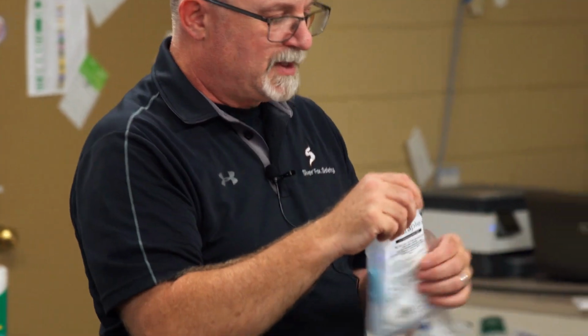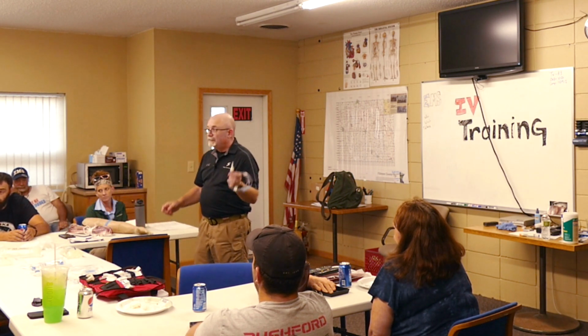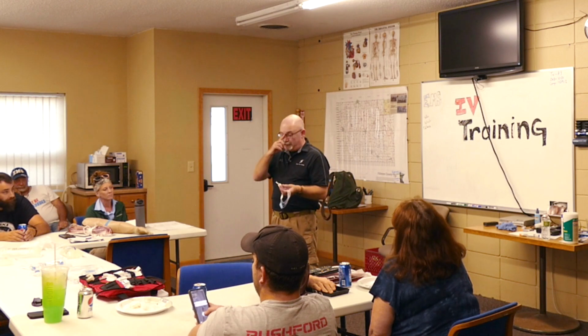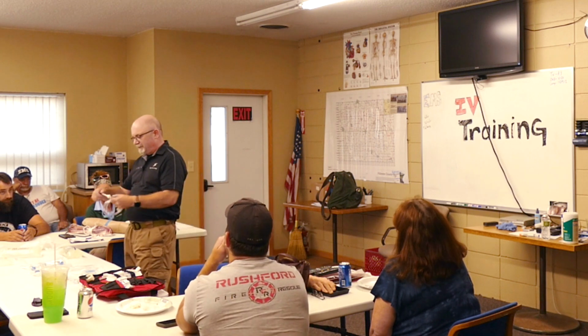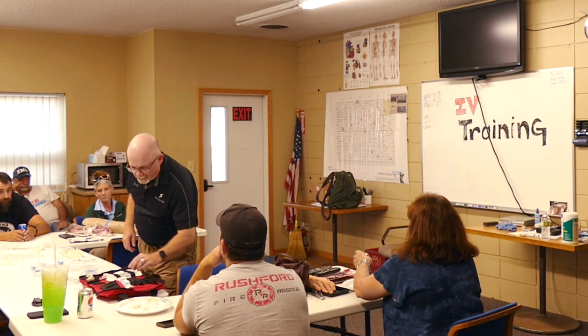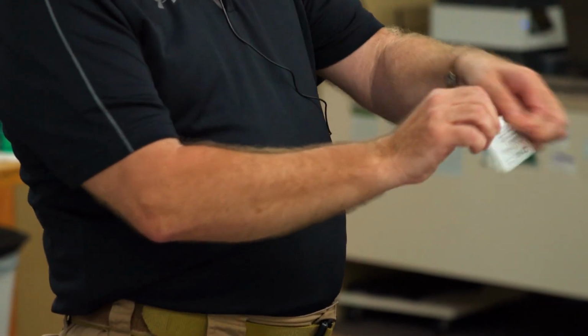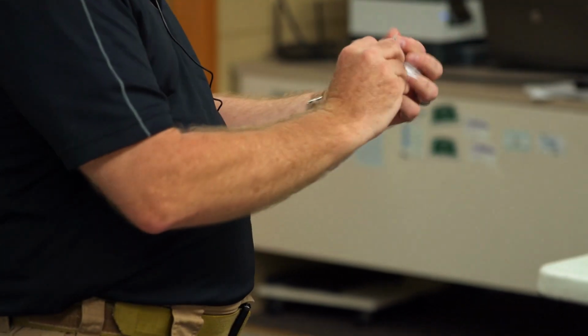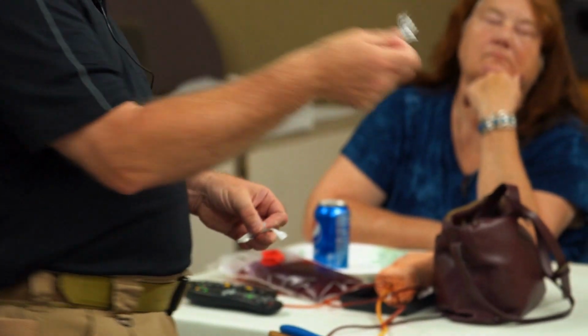It's also got that. So at this point, anybody not familiar with aseptic technique? I think you should review it. We'll review that. The idea being things that are sterile should remain that. So I don't have my alcohol prep. Even to the point of doing things where I've got my gloves on, but those are just clean. When you hand over a bandage or a swab, you tear it, I didn't tear that very well, but when you're handing your partner something, you're not touching it, you're limiting the amount of exposure to whoever might be contaminated.